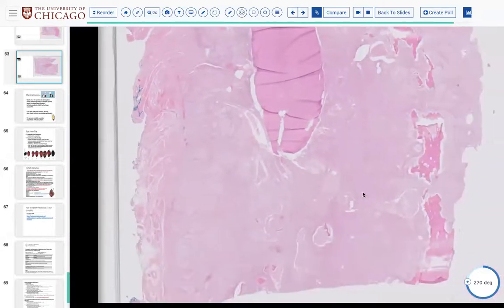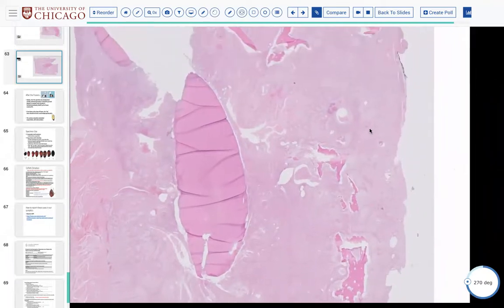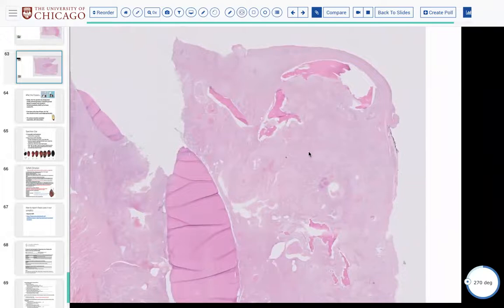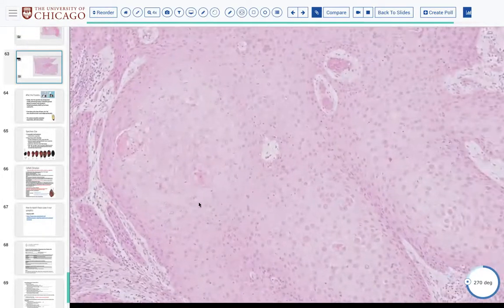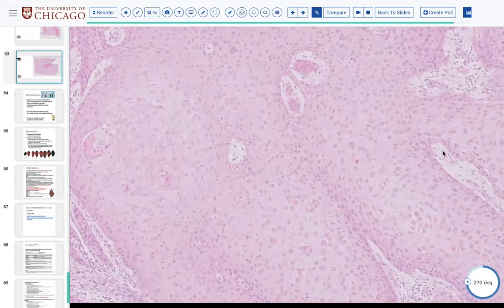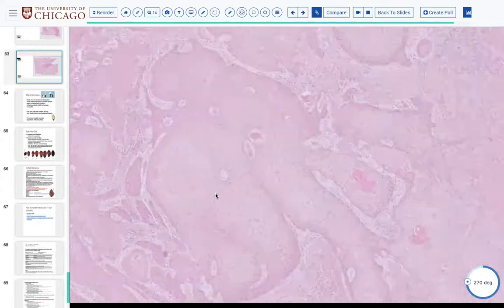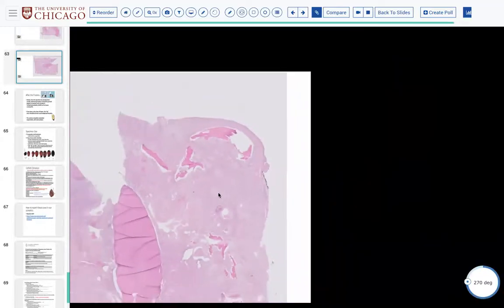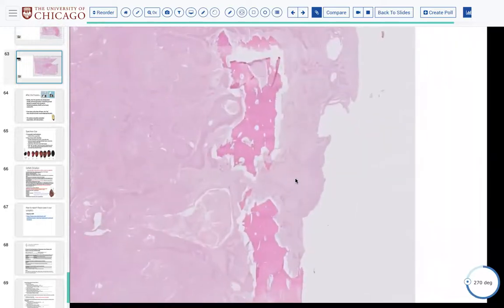And so this is not only a good example of how these frozens can be challenging due to sampling error and interpretation variability, but also a good example of why we don't grade squamous cell carcinomas. You're going to give this a well differentiated histologic grade, but this is not behaving like a nice, well differentiated tumor.